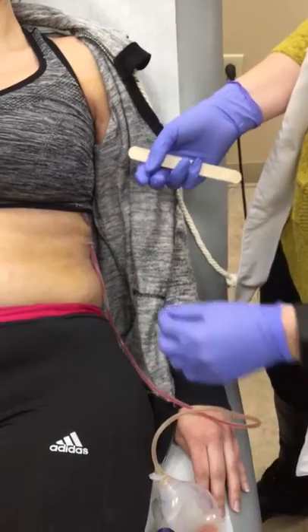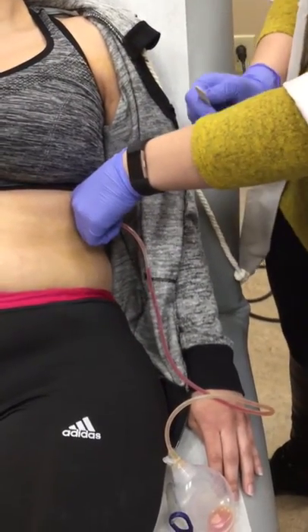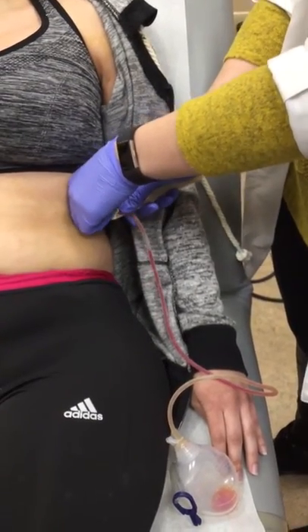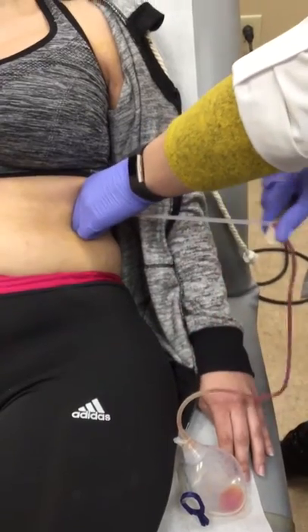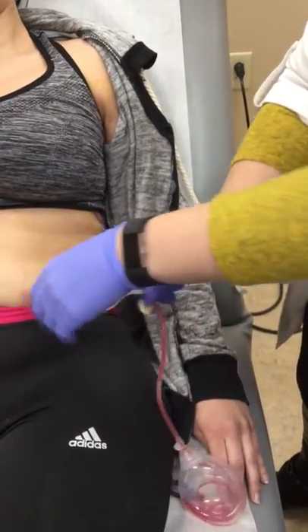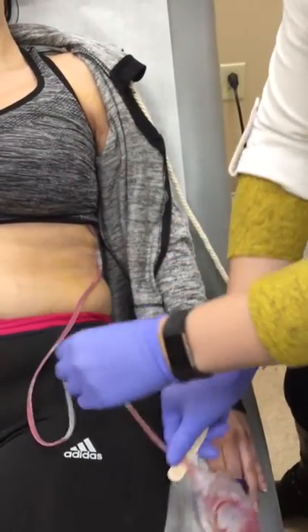What you want to do is take your non-dominant hand and anchor up towards the patient, then take your dominant hand and either use your fingers or a tongue depressor and work the fluid from the top to the bottom. Make sure that you do anchor, otherwise you can pull it out. What this is doing is getting any tiny piece of clot or debris out of the tubing itself to make it a patent system.